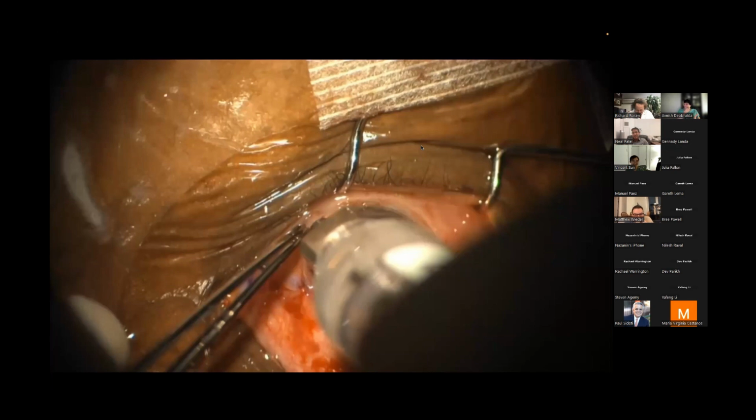Yeah, it will, but you can make the pressure pretty high with viscoelastic. Why not leave the air in? Air is a problem with a small pupil if the patient's lying flat. The air will go away pretty fast. And if you keep the patient's head up a little bit, there will generally be a little bit of space down below. The pupil's going to stay dilated for a little while. I think you'd be okay. Yeah, but Dr. Sidoti, in this case, the visibility was also a problem. So sometimes you don't have a choice.